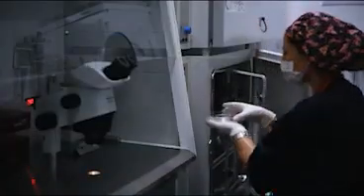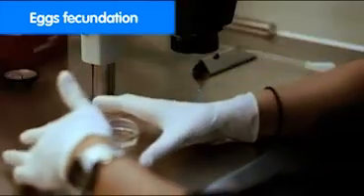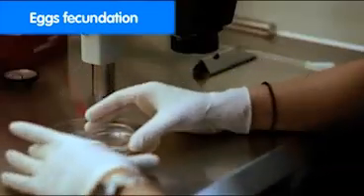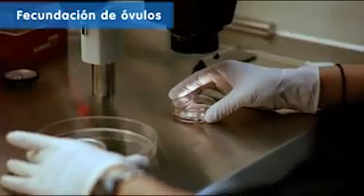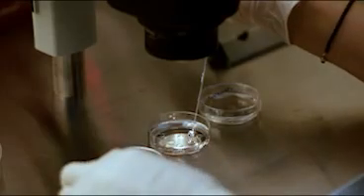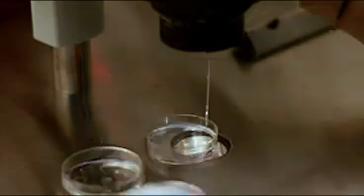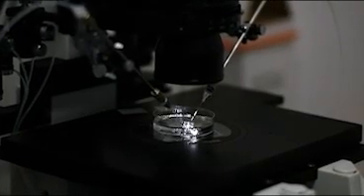Next, we fertilize the ova. This process can be performed via the conventional IVF technique, which consists of placing an ovum surrounded by spermatozoa in a culture plate, or via the technique of ICSI, which consists of inserting a live spermatozoon into the ovum by puncturing it with the aid of a pipette.